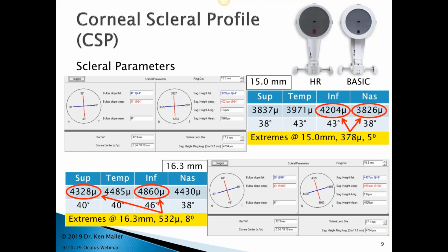You can just use the general output that comes directly from the central scan of the Pentacam. That's going to give you data out pretty far, and then you can design a corneal lens from that as well. As far as wave goes, again, it interacts very, very well with wave. And I've had a chance to design many corneal lenses with the wave software using the CSP, and it's very, very reliable. It does a very, very nice job.